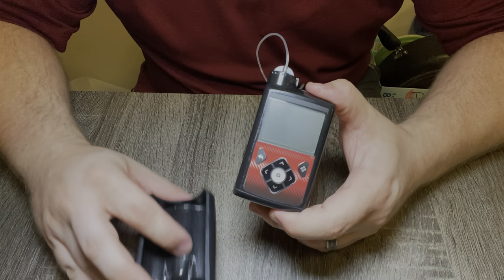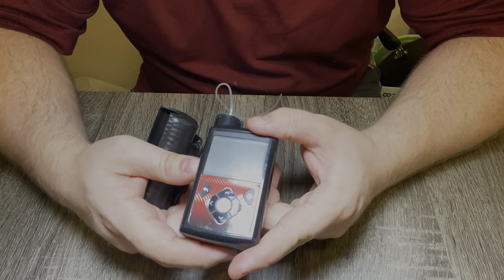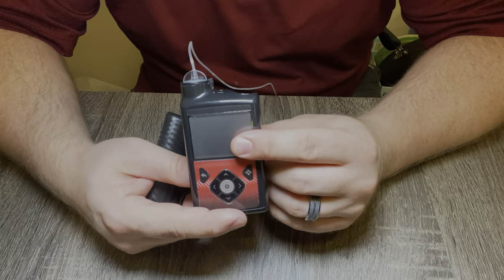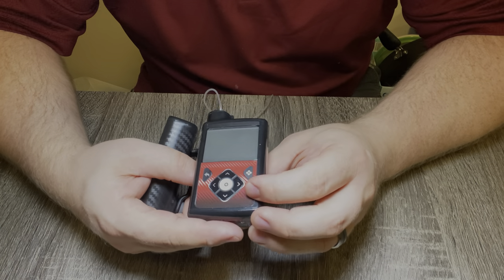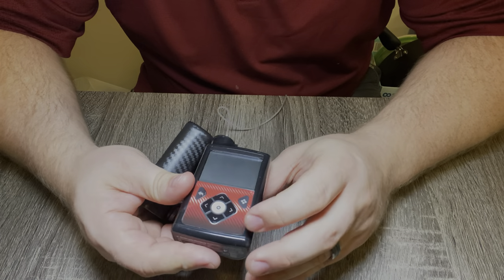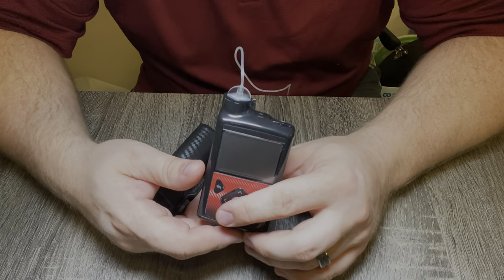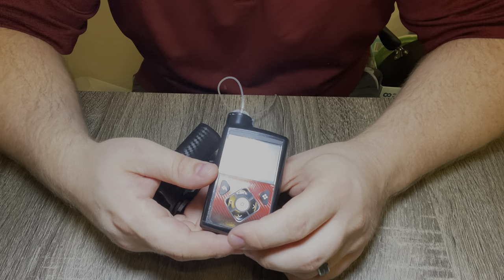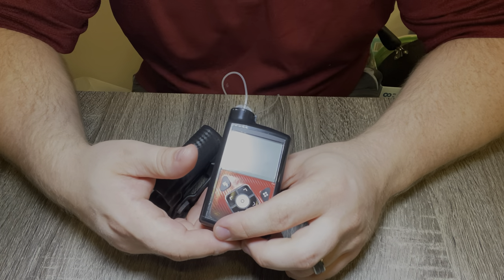When I first got my insulin pump I kind of had a mini freakout session because I realized just how much this thing costs — it's just a lot of money. I've been contemplating over the last couple months how I'm going to keep it safe when I'm out and about. I'm a pretty active person, I carry a lot of things on my person, and adding a pump seemed pretty overwhelming.